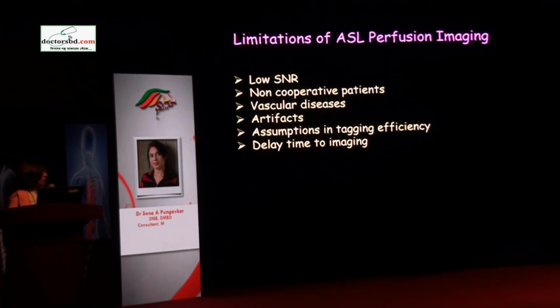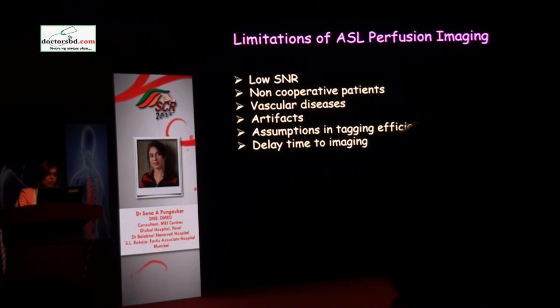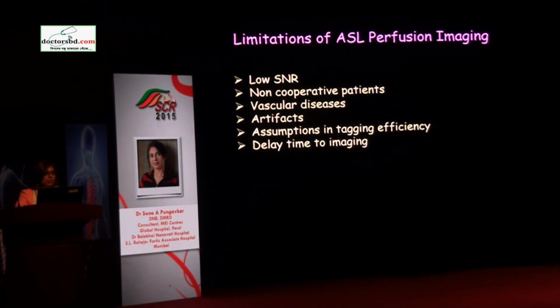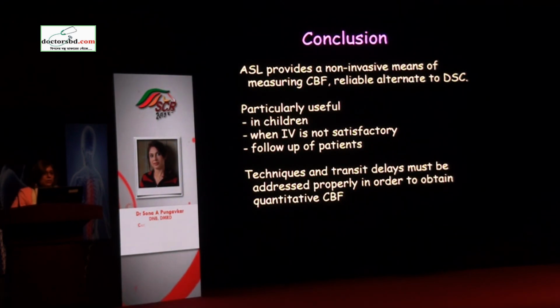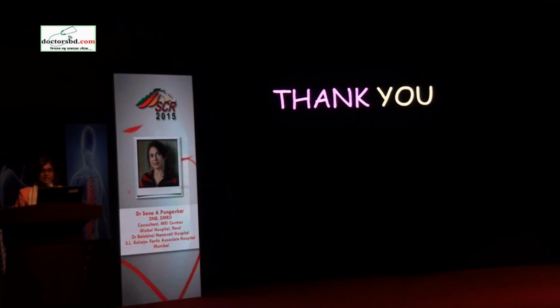Disadvantages are that you have low SNR. If the patient is moving, that may be an issue, but that can happen in any MR study. And we are assuming certain parameters, like I told you, the post-label delay, which we do not know whether we are accurate on. Some more research is required in that. And just to conclude, it is a non-invasive means of measuring CBF and a reliable alternate to DSC. I thank you for patient listening, and if there is any question, I will take it.